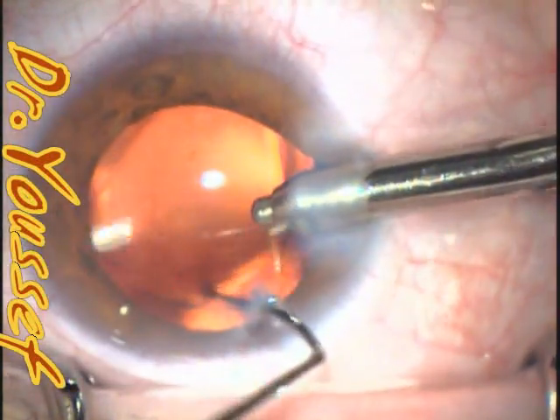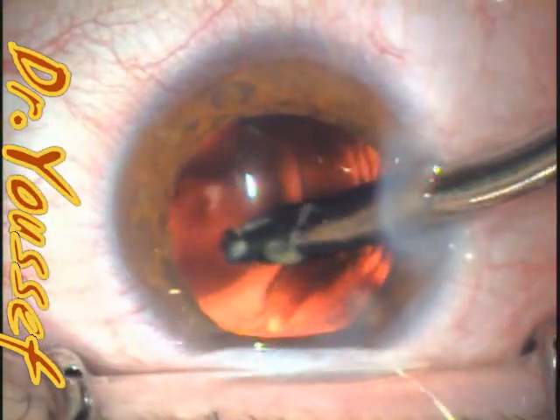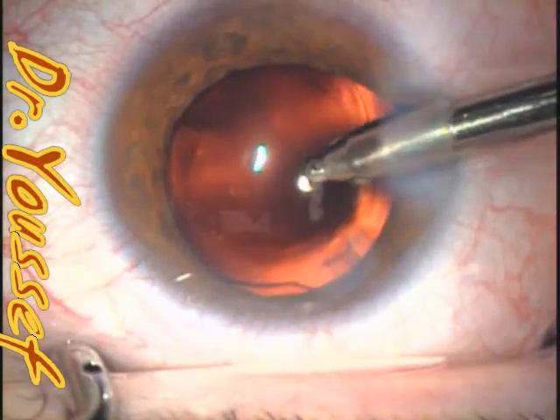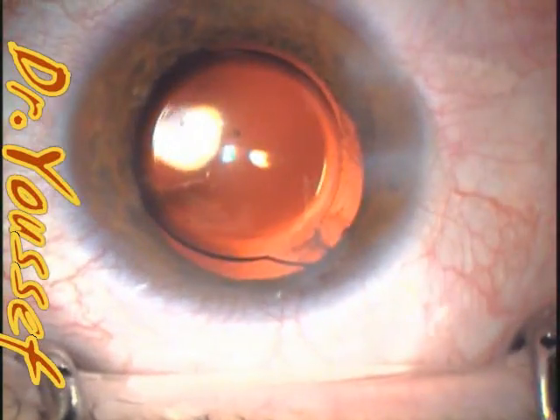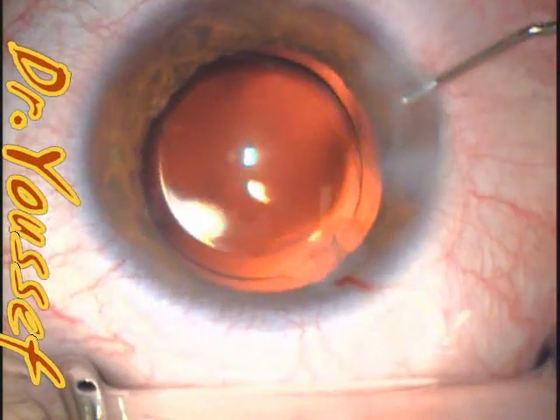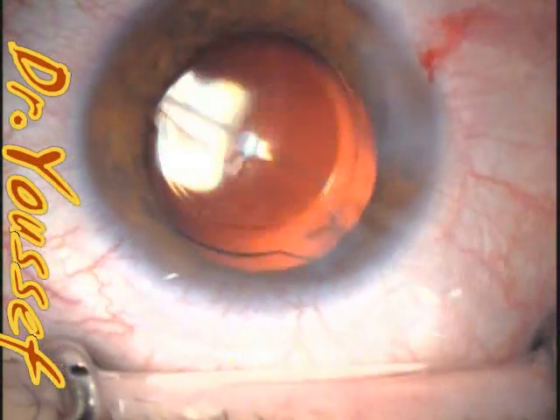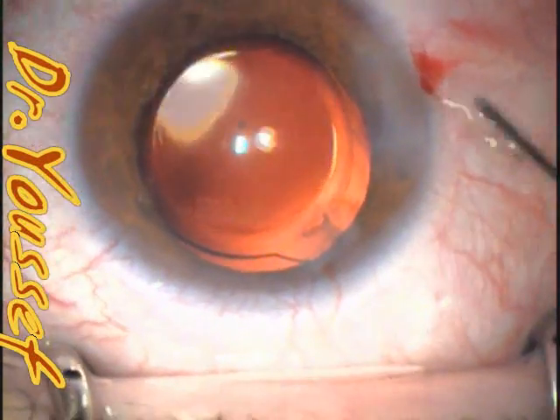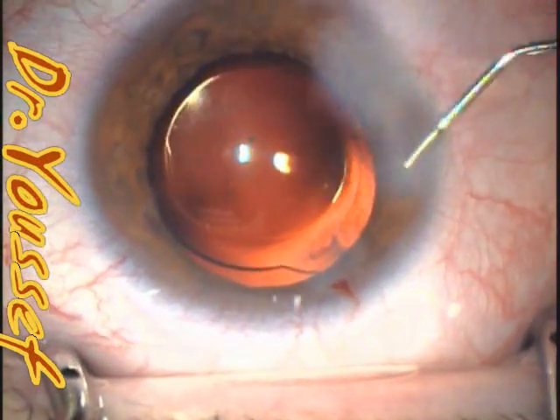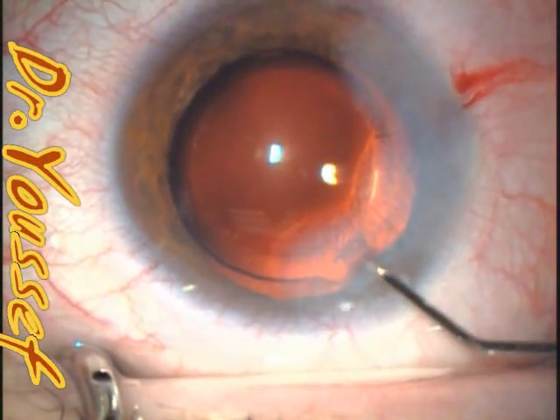Some Sinskey hooks are sharp enough to open the capsule, so you have to be careful. After reuse, the tip can become a little sharp. It happened to me once that a Sinskey hook opened the capsule while I was positioning the lens. So be very careful with that. The haptic went back into the bag and we're good.